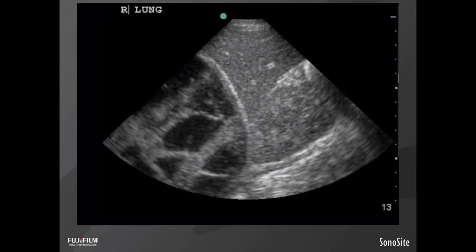So here's an example of a TB-related pleural effusion, which is septated. It's actually pushing, the effusion so large it's pushing down on the diaphragm and it is flattening it, and you can see all of these septations within it that cause kind of a reticular pattern inside the effusion. These are actually pretty tricky to tap, so it's good to know ahead of time what you're getting into.